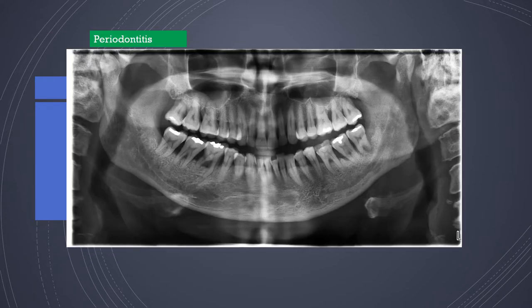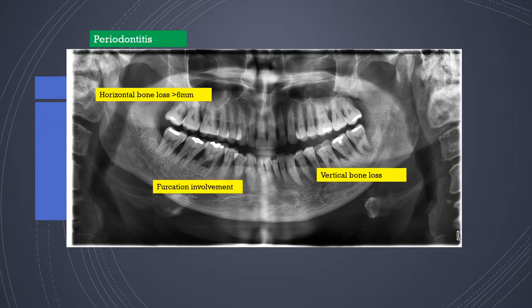For periodontitis, in cases where there is severe bone loss, horizontal as well as angular bone loss, panoramic radiography is a very important assessment tool. You can assess greater than 6 mm bone loss, vertical bone loss, and furcation involvement, which can be clearly seen.